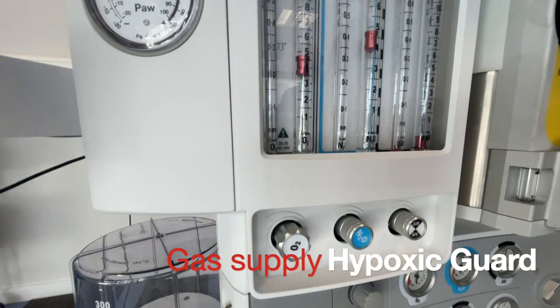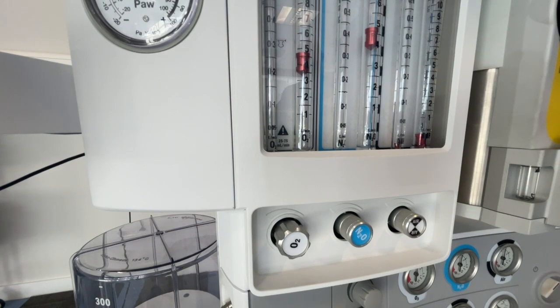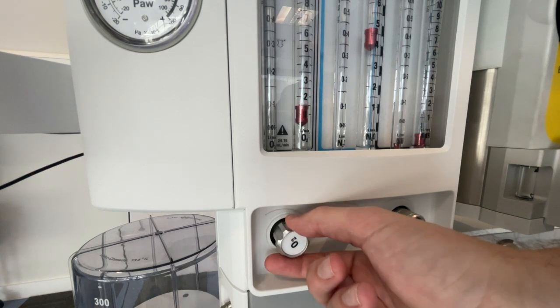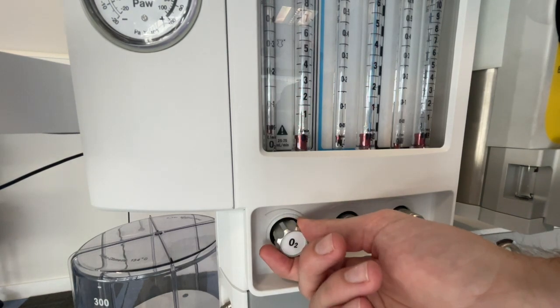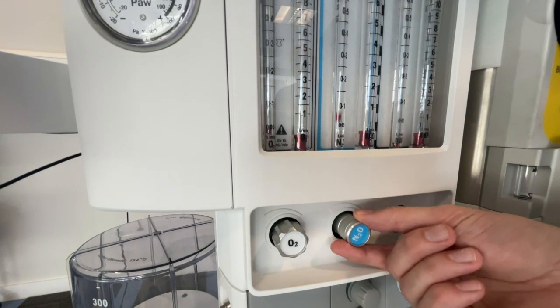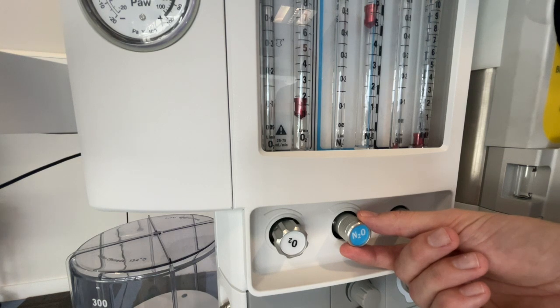The hypoxic guard is a fail-safe mechanism to ensure that we cannot deliver a hypoxic mixture to our patients. On this particular machine the hypoxic guard is called a Link 25 system, because the oxygen and nitrous oxide are linked together in such a way that the minimum concentration that can be delivered is 25% oxygen. When you turn the oxygen off, the nitrous oxide should stop as well. If the nitrous oxide is turned on on its own, then the oxygen should follow, and note that it stays at a ratio of 25%.